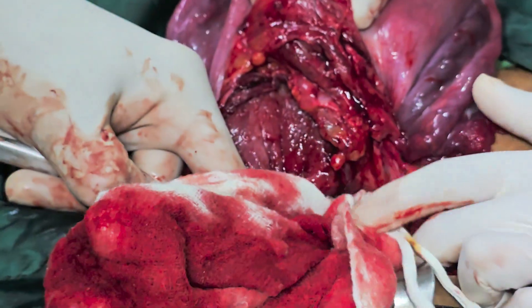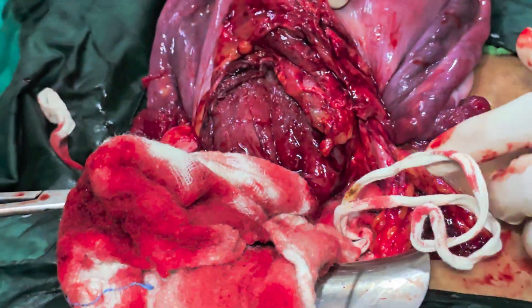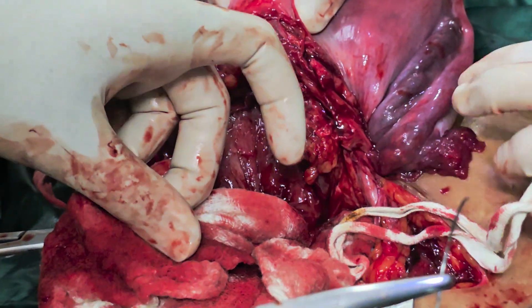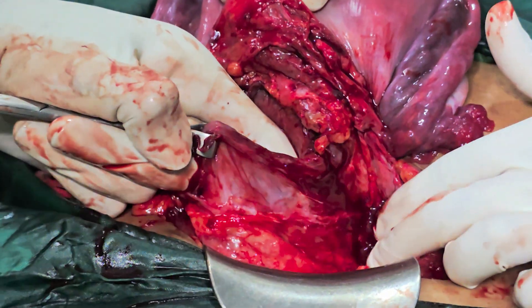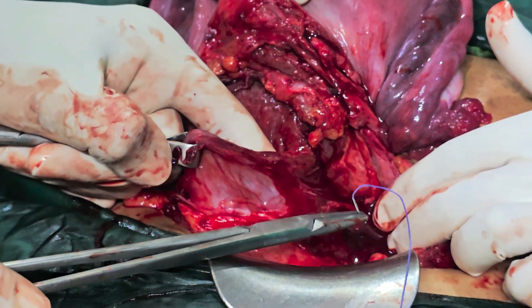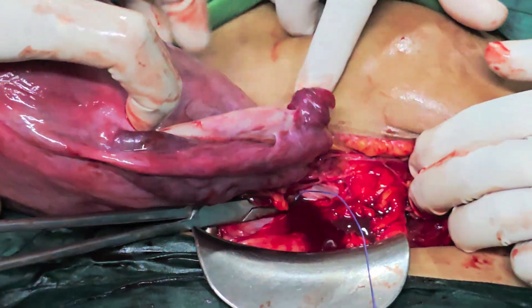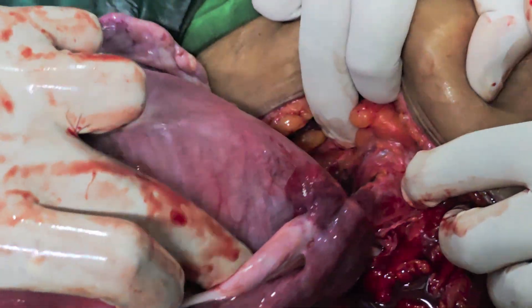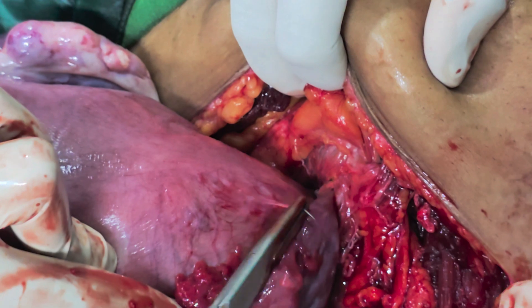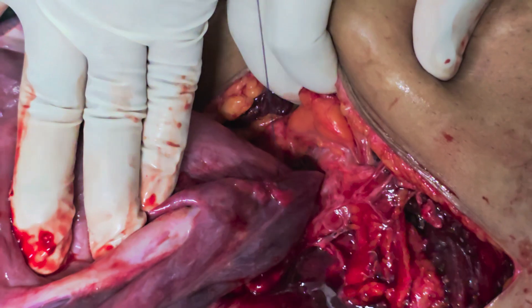The first step is to dissect the bladder. It is preferable to use a longer needle; however, I am using a conventional 40mm needle here, but you can take a 50mm needle. The first point will go 2cm below. I am going in — you can see I am going in and now I have to come posteriorly. I have come out posteriorly. The assistant will stretch the uterus. This is your first bite.